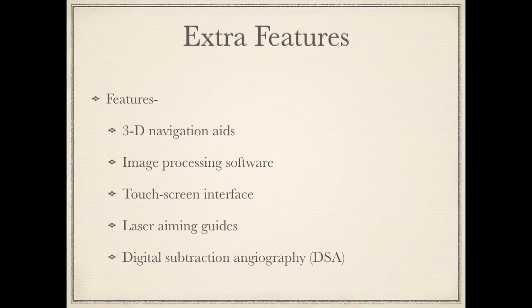I've found that the knowledge about the C-arm controls has come in handy on a number of occasions for me. Like when I get new radiographers who are not my regular radiographers and they are struggling to get me a good image, just a few suggestions or a few taps of buttons to help them have helped me do the procedure better and minimize the radiation exposure for everyone.